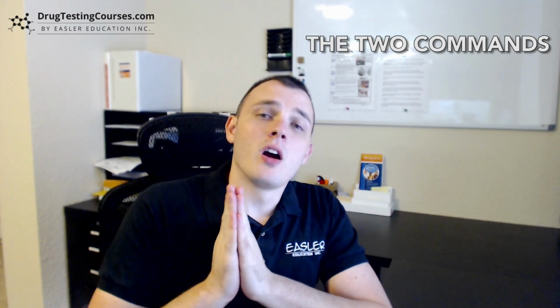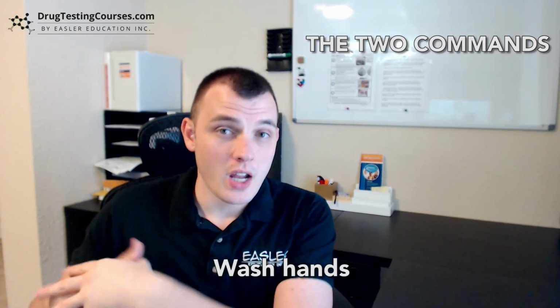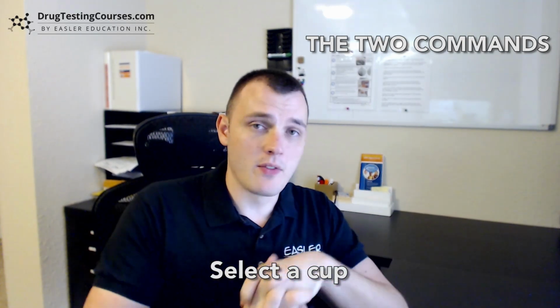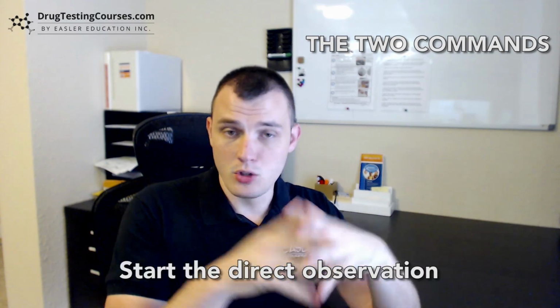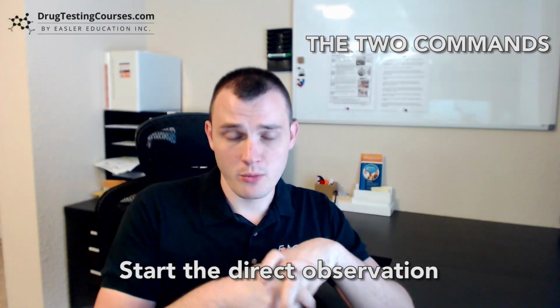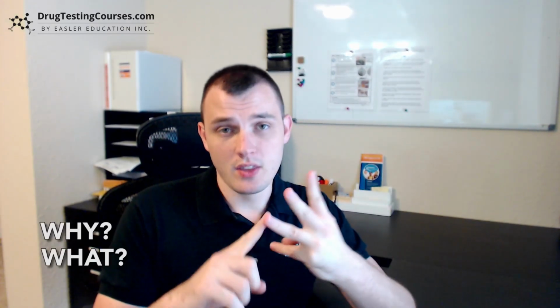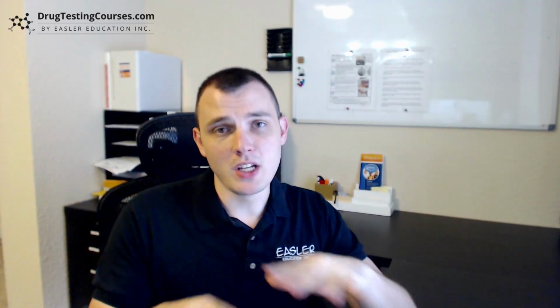That's going to be, all right, so for right now, what I need you to do is go ahead and wash your hands and select the cup. Okay, and then you walk over there, have her wash her hands, select the cup, and then you can start working with her, going right into that direct observation procedure from there. So those are our 3 different tips and tricks, 3 little strategies, the why, the what, and the 2 commands, for us to go ahead and get these direct observations completed properly and efficiently without too many hassles.